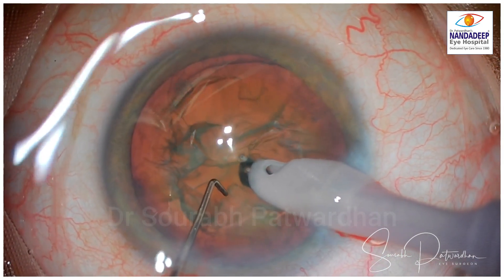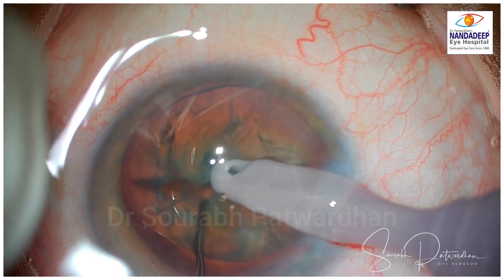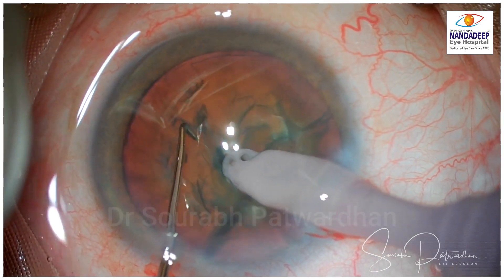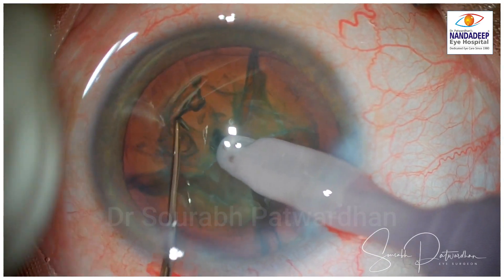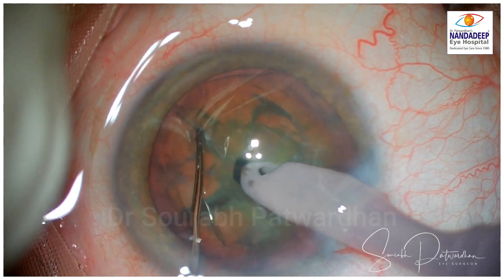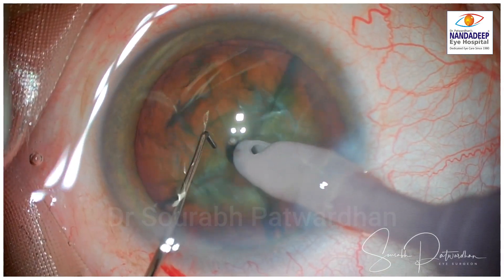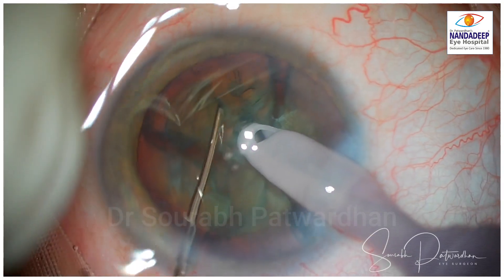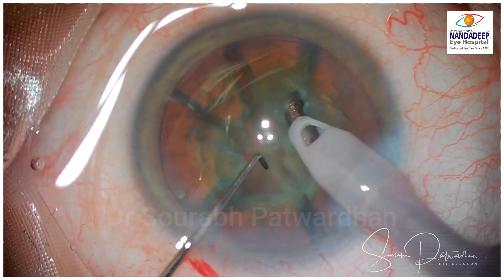When the irrigation is in, the AC deepens and some fluctuations are seen. While doing phacoemulsification, I am going to do primary chop using longitudinal phaco. Many of my colleagues ask just to show a case of how to align the toric IOL properly. For complex situations like small pupil where you cannot see the marking dots, I have already made a few videos on how to mark it pre-operatively using the eye toric app.